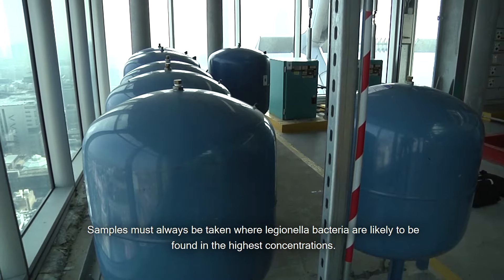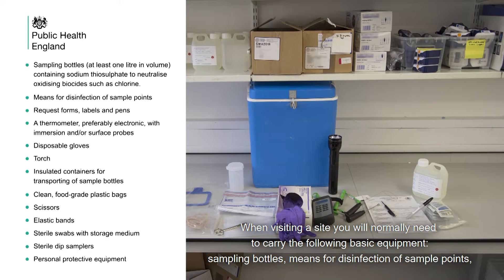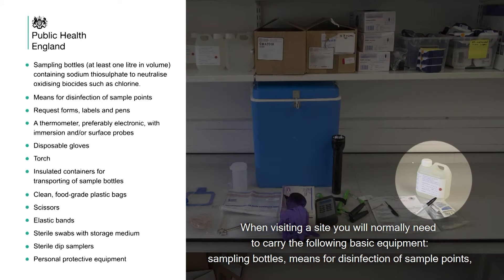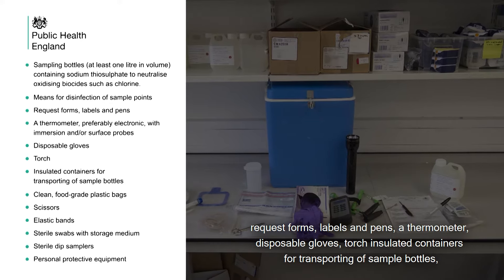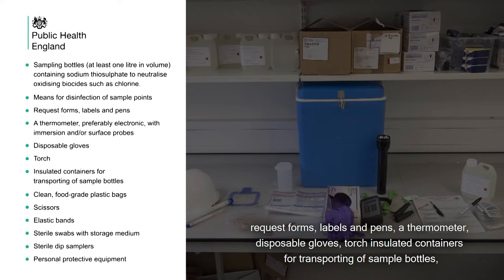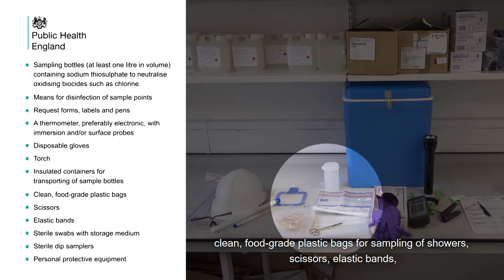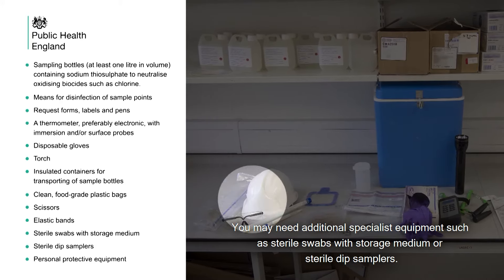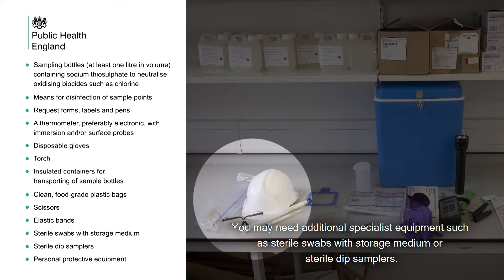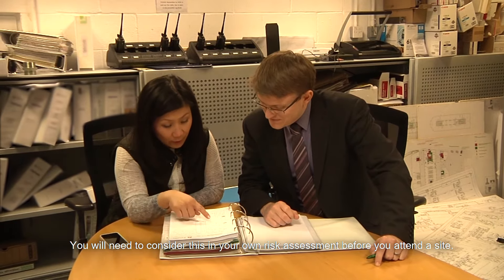Samples must always be taken where Legionella bacteria are likely to be found in the highest concentrations. When visiting a site you will normally need to carry the following basic equipment: sampling bottles, means for disinfection of sample points, request forms, labels and pens, a thermometer, disposable gloves, torch, insulated containers for transporting sample bottles, clean food grade plastic bags for sampling of showers, scissors, and elastic bands. You may need additional specialist equipment such as sterile swabs with storage medium or sterile dip samplers. The type of site and work activities may also mean you will need safety shoes and goggles. You will need to consider this in your own risk assessment before you attend a site.